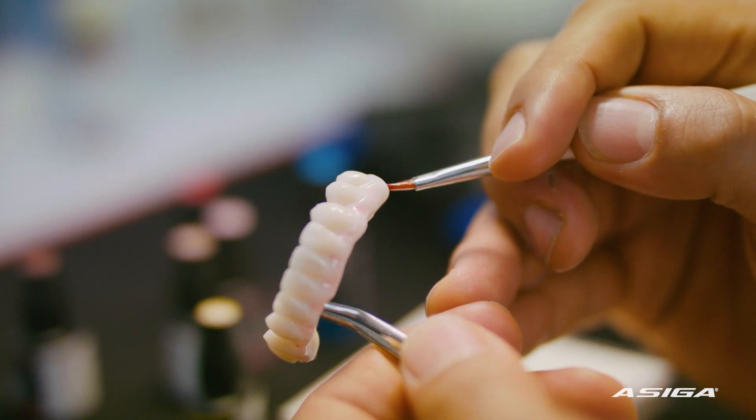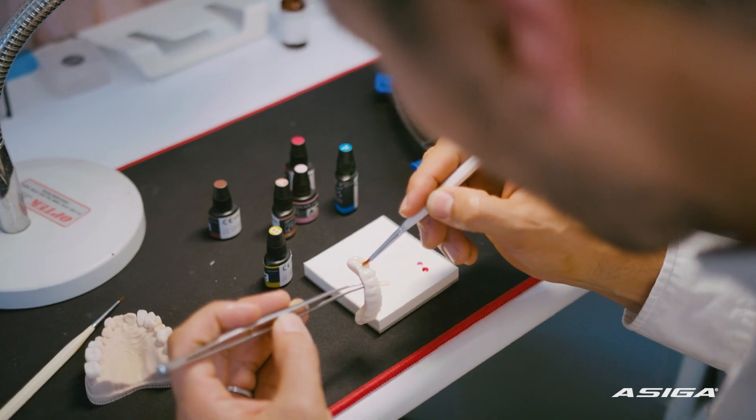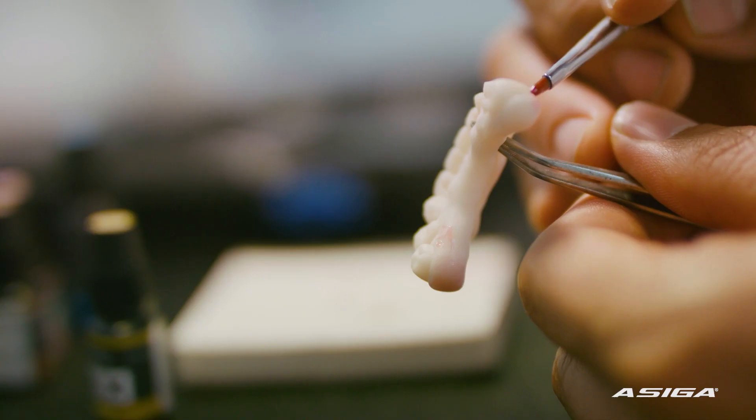The result is really natural. Everything is the same as the scan — I'm really happy with that. Once we tried it, it was just amazing. It was like a whirlwind, because all the things that we had issues with with our previous printer, Asiga had the answer for.